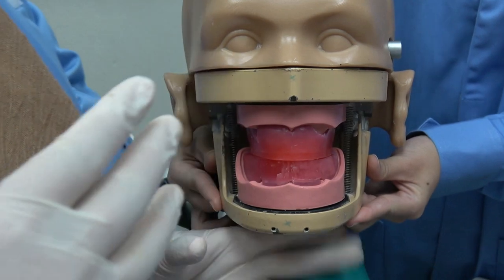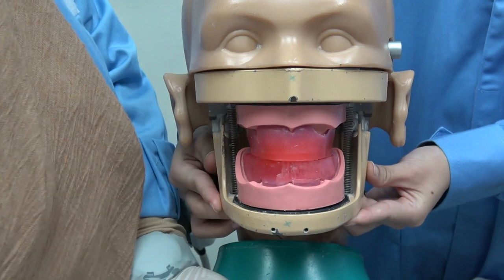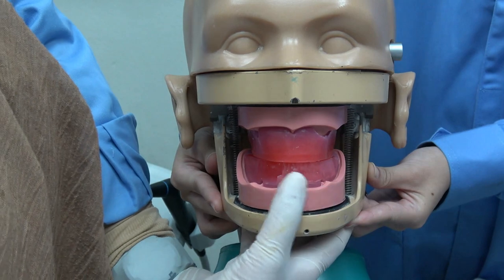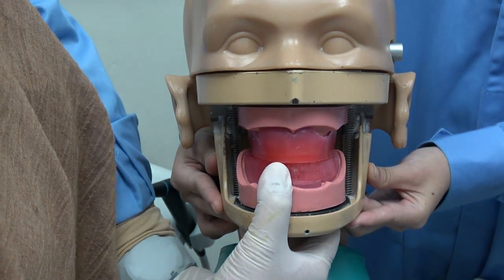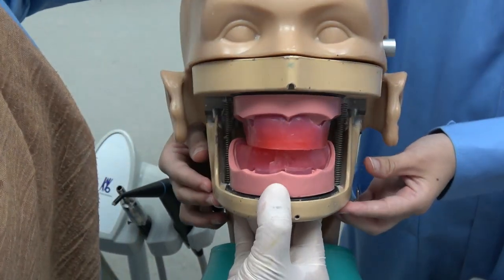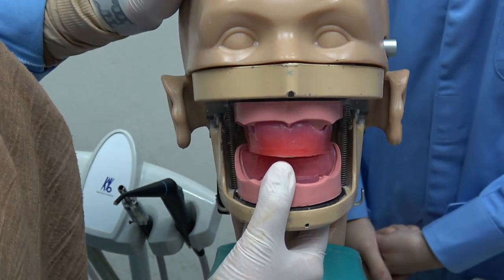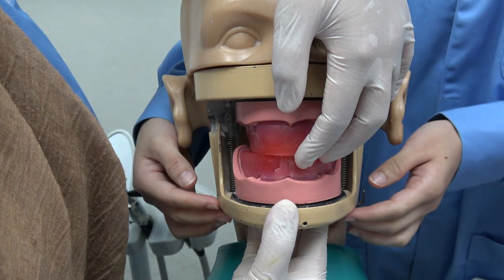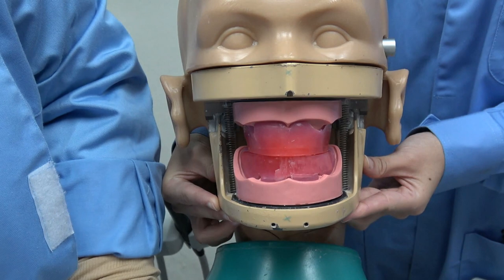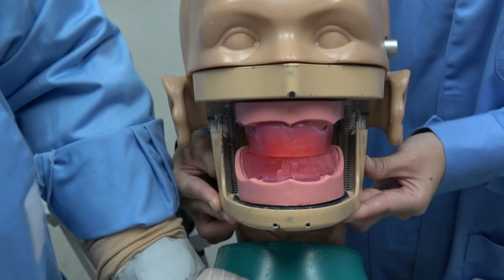Actually in the real patient, you have to put your patient to bite in the RCP, which is the retruded contact position. But for this exercise you can bring the jaw in front. Actually you have to bring the jaw to the back like this, in the real patient. You have to ask your patient to bite in RCP. But we make it to class 1 like this. Assuming this is your RCP, and then you mark the midline.